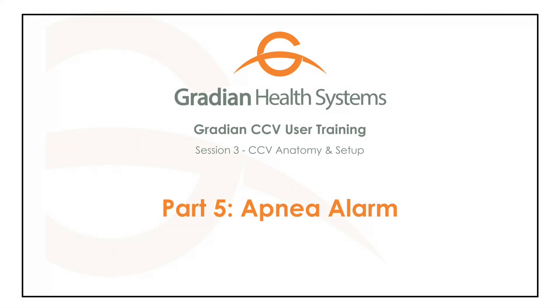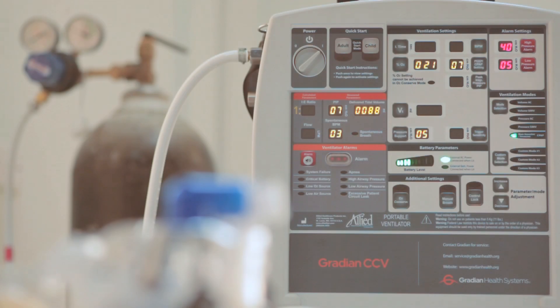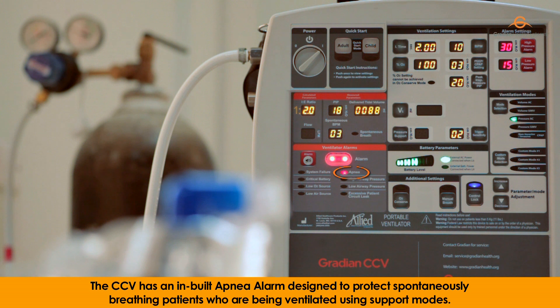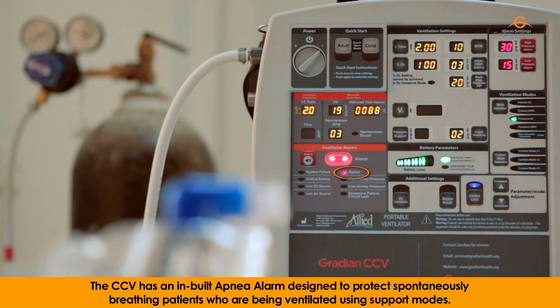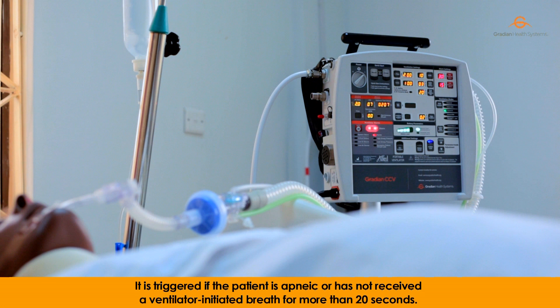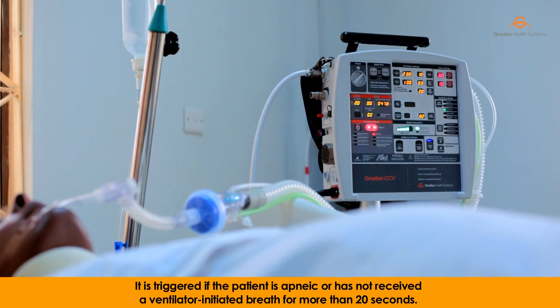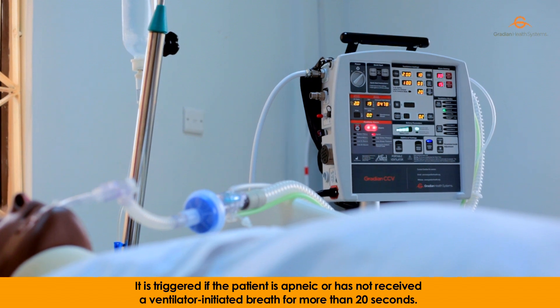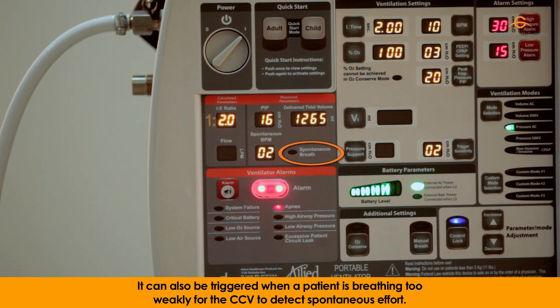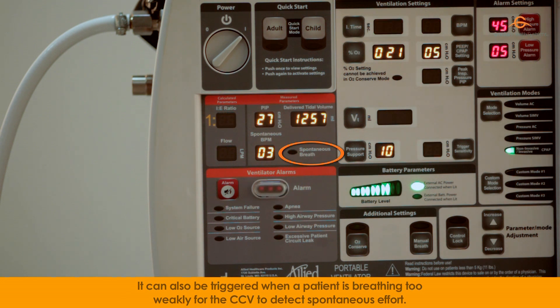Apnea Alarm. The CCV has a built-in apnea alarm designed to protect spontaneously breathing patients who are being ventilated using support modes. It is triggered if the patient is apneic or has not received a ventilator-initiated breath for more than 20 seconds. It can also be triggered when a patient is breathing too weakly for the CCV to detect spontaneous effort.